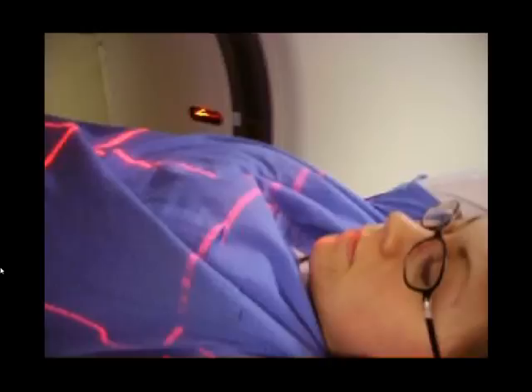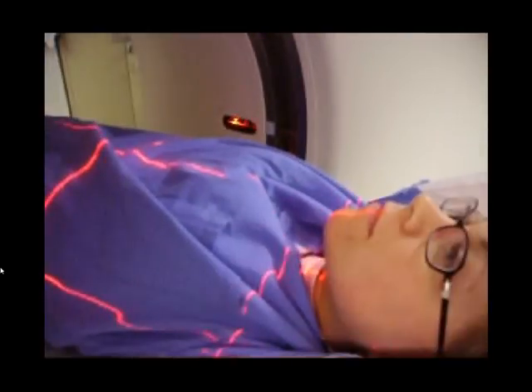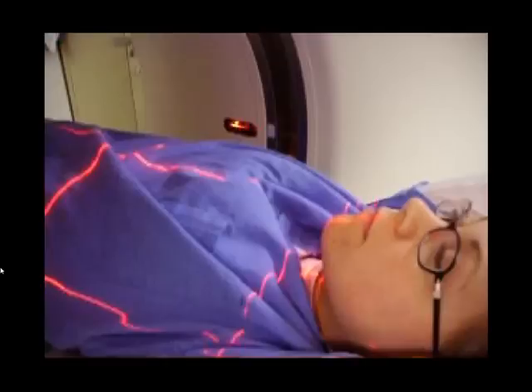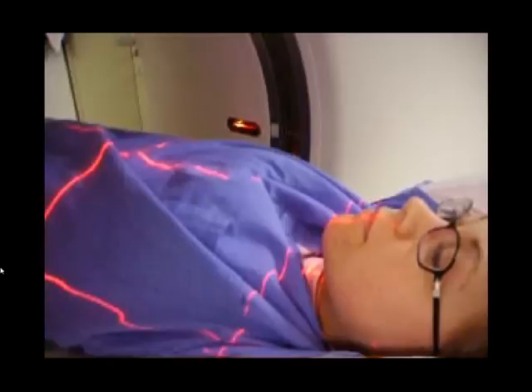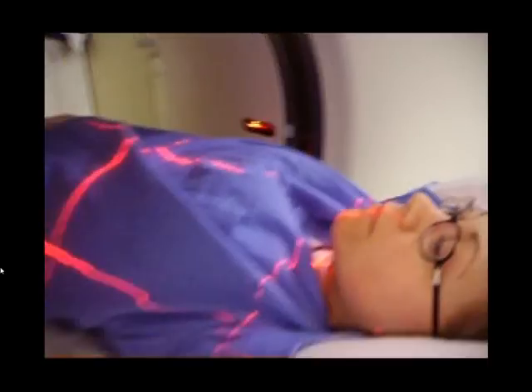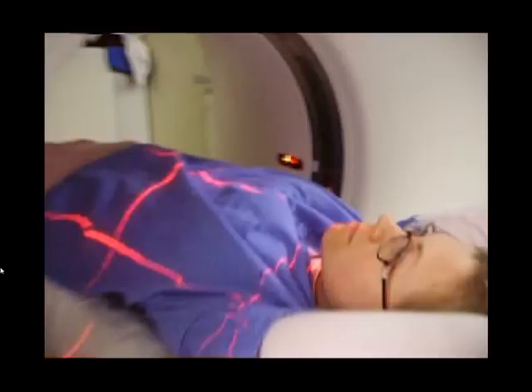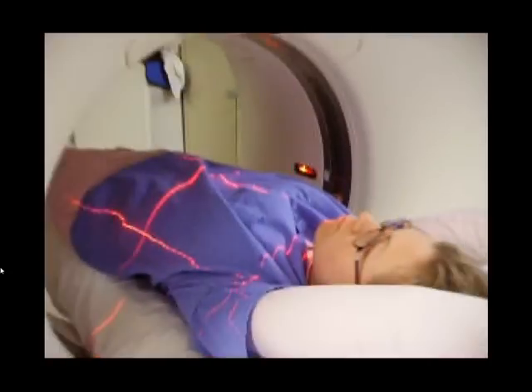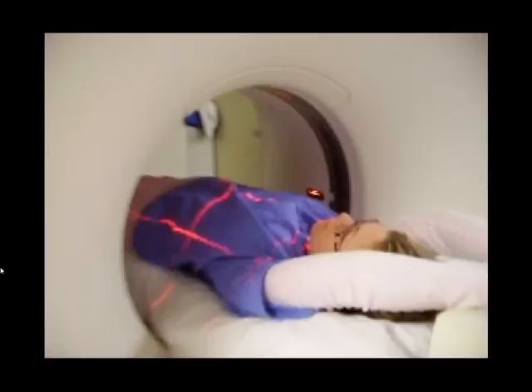Now, dressing the patient, you need to make sure that they don't have any jewelry on in that area, so you need to make sure they don't have any necklaces on, no piercings, anything metal that could be in the way of your scan. And there you go. That's what it looks like when you've got your patient correctly positioned in the gantry for a chest CT.